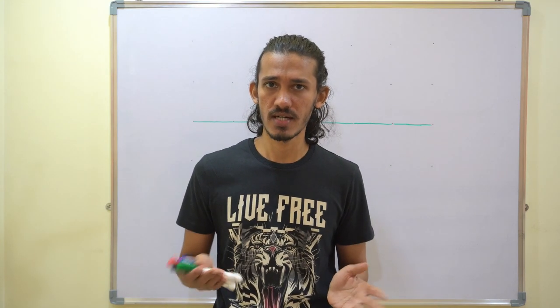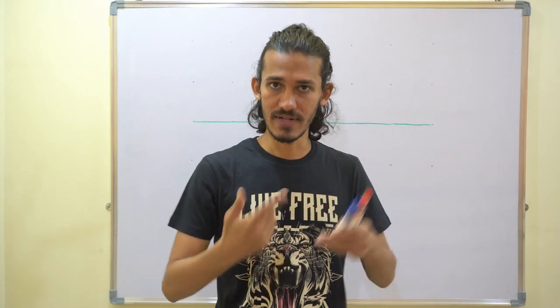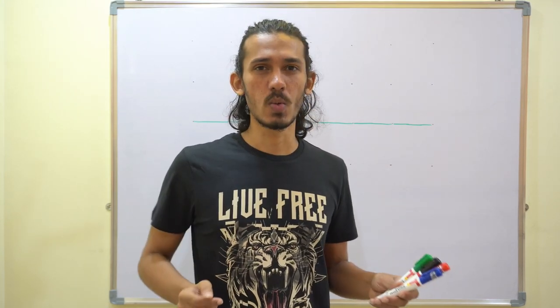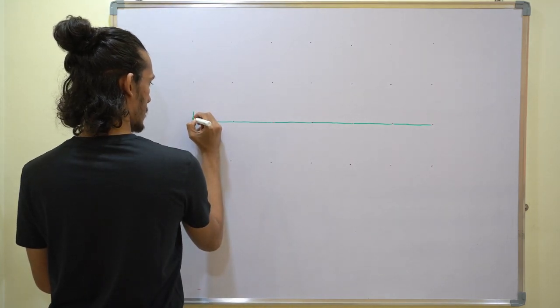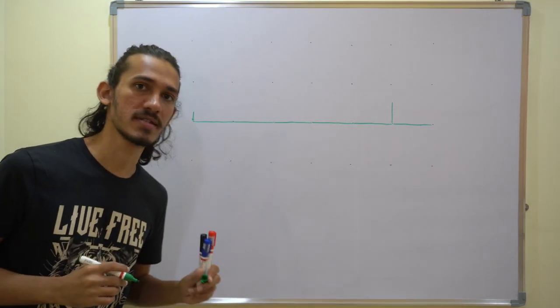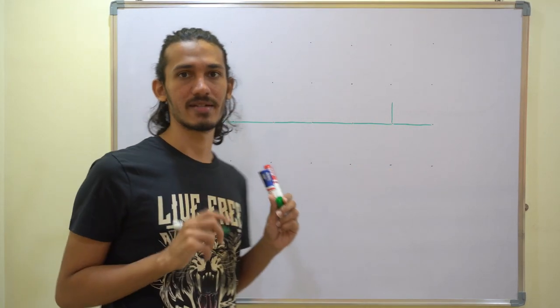So this ECG is recorded on paper, right? The paper is the electrocardiogram. So on that paper, what happens when it's recording is that the speed is such that it covers 25 millimeters in 1 second, right? 25 millimeters in 1 second. So let's say it started from this point. It covers 1, 2, 3, 4, 5 large boxes, and each of these large boxes has 5 smaller boxes. That is 5 into 5, 25. So each small box here is 1 millimeter.